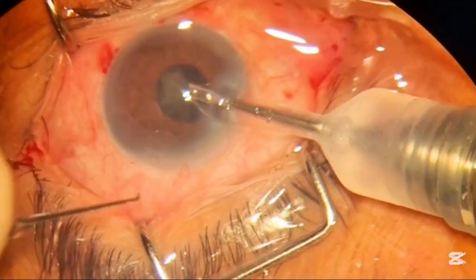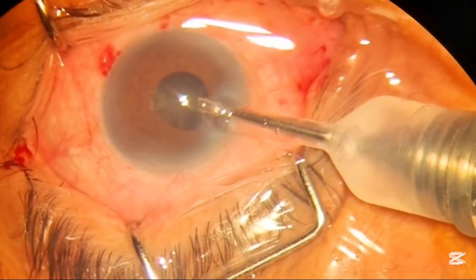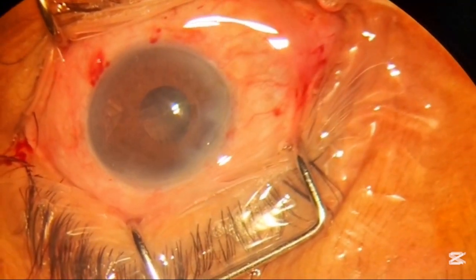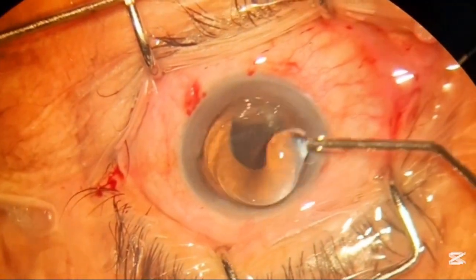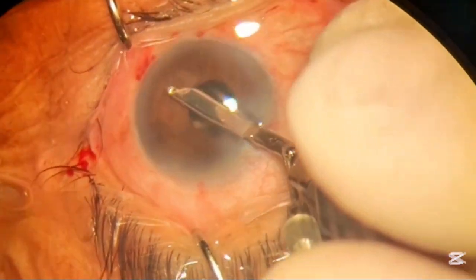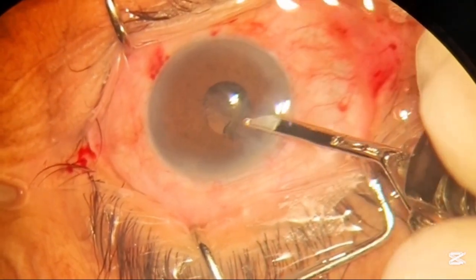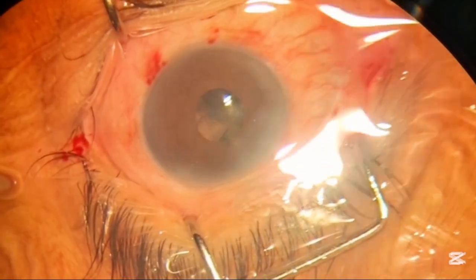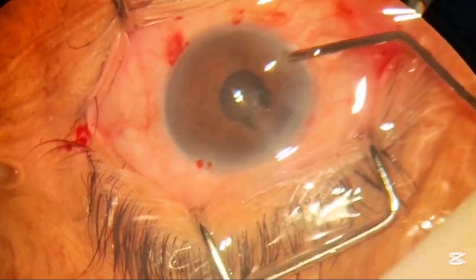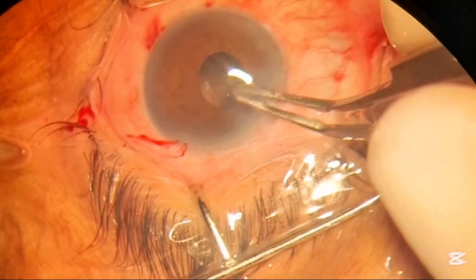Now we are done with all the pieces. The next step — you can see the pupil is very small in this case. We will now remove the lens matter that is left. You can see there is a small piece present, so you don't need to remove it with the FACO tip to avoid any unexpected complications — you can remove it with the gel and the McPherson forceps by just crushing it.